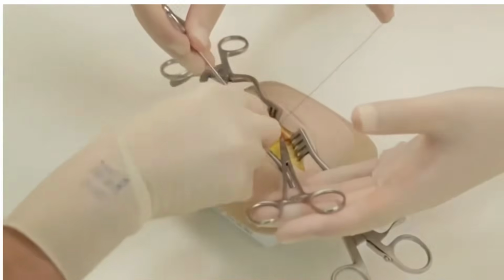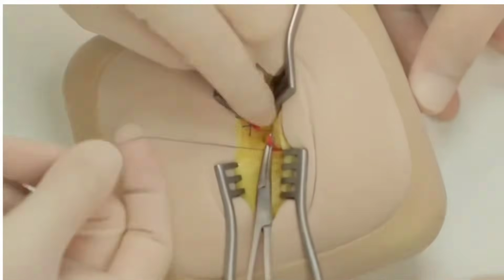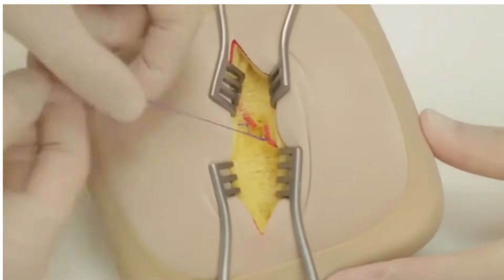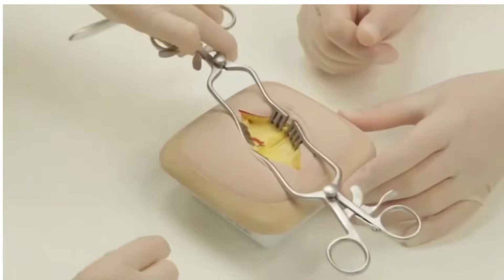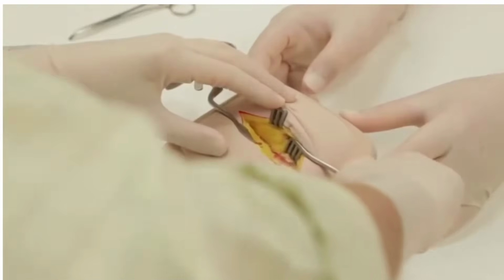Split the internal oblique and transversus abdominis along their fibers, taking care not to injure nerves. Enter the peritoneum under direct vision.